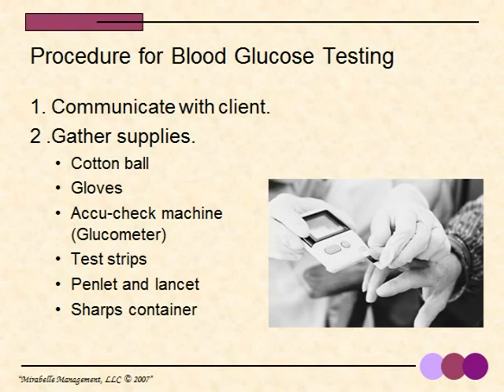Previous practice recommended using alcohol wipes when cleansing the area to be tested. Recent studies indicate that this may interfere with the accuracy of the results. Now it is recommended to perform the test on a clean hand or wipe the area with a moist cotton ball.